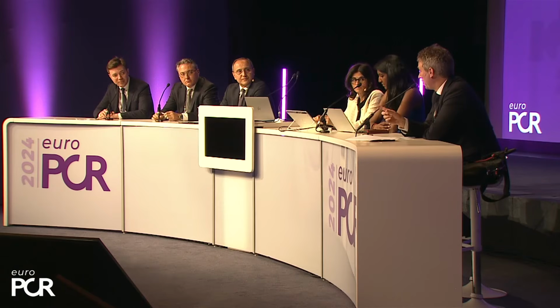Yep. I mean, I think it might have been a pertinent consideration here because you'll see they use the liquid guide catheter extension, which most people may not have in their cath labs, which we did clinical investigation with. It's a little bit stiffer. It's a circumflex. It's a little bit more challenging to deliver. And maybe that was why they used the inchworm.